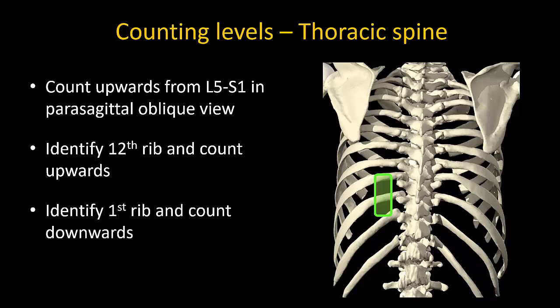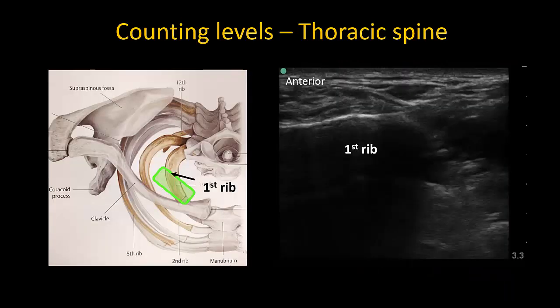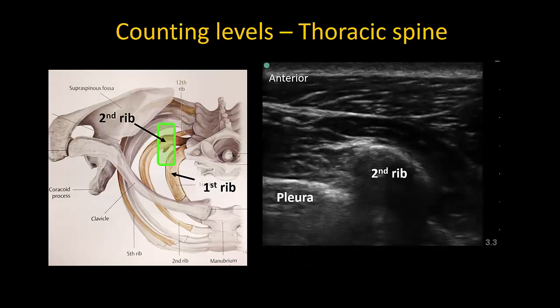Third, and my preferred method for the upper thoracic spine, you can identify the first rib and count downwards from it. To identify the first rib, place the ultrasound probe in the supraclavicular fossa as though doing a supraclavicular brachial plexus block. The first rib is easily identifiable as an elongated hyperechoic structure with the subclavian artery and the brachial plexus lying on it. Then move the probe along the root of the neck and posteriorly, staying medial to the scapula. This will bring the posterior part of each subsequent rib into view. The first rounded shadow that appears after the first rib is the second rib — it is not the posterior part of the first rib, as you can appreciate from the graphic.